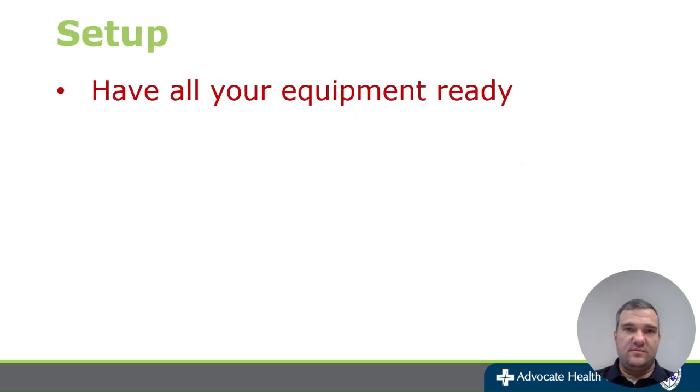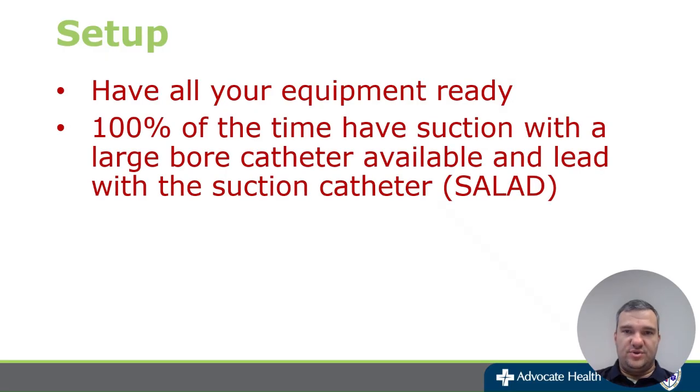So talking through the setup a little bit here. Make sure you have all your equipment ready. Obviously that makes sense. You guys carry an intubation kit in regards to all the equipment that you need. And then moving on, you should always use suction. Always should have suction ready to go on these intubations.